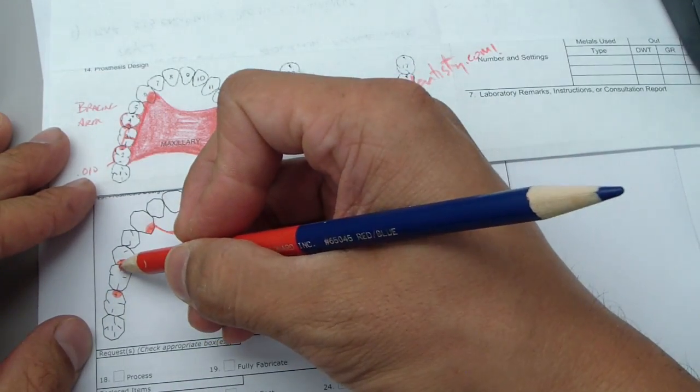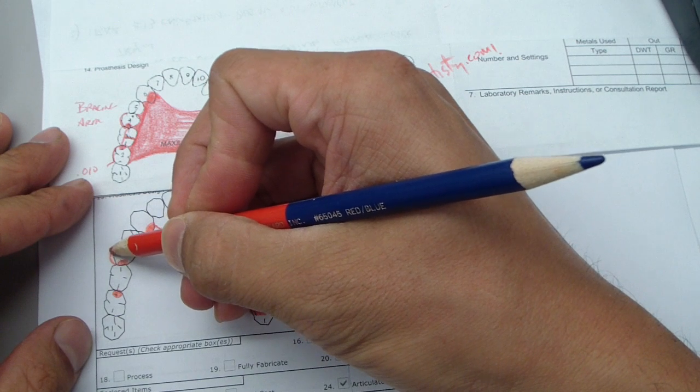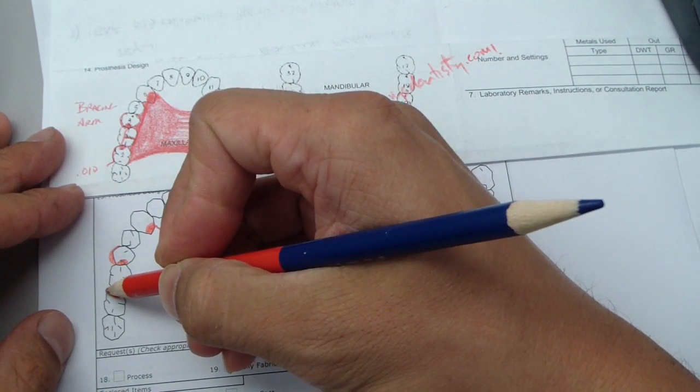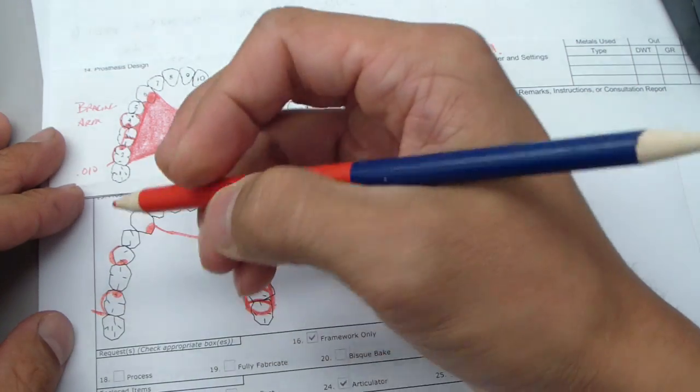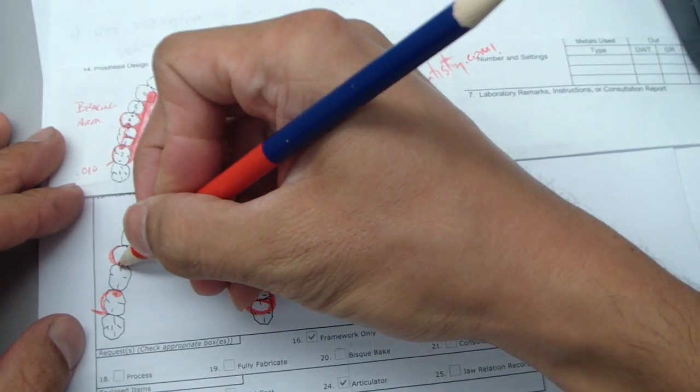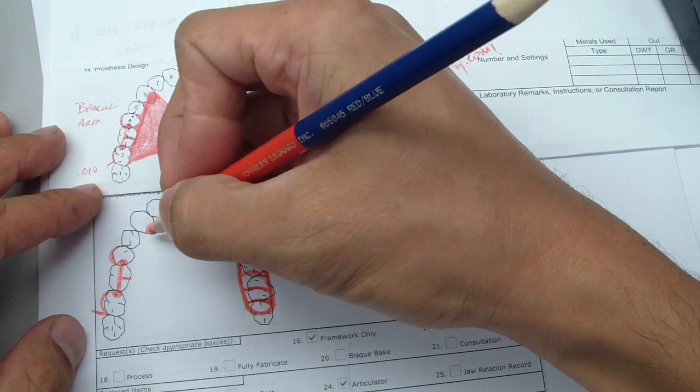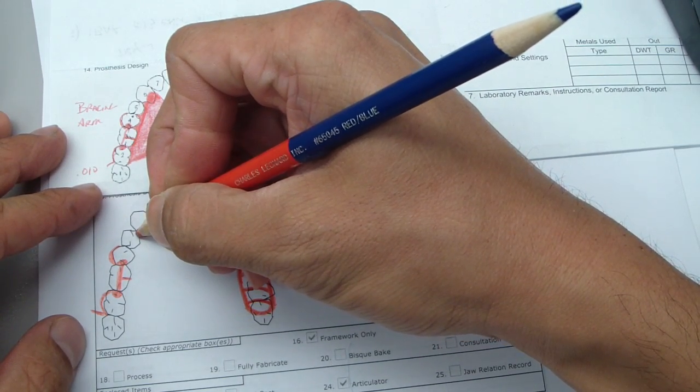And this is going to engage an 0.01 undercut. And then this is a bracing arm - there's no undercut here. And then we have a distal buccal undercut here. And then we join these two because we want a denture tooth there. Some framework, and we're just going to plate all of these.